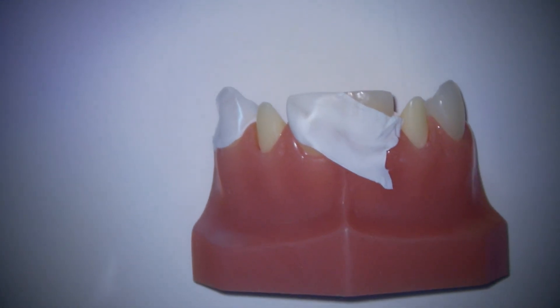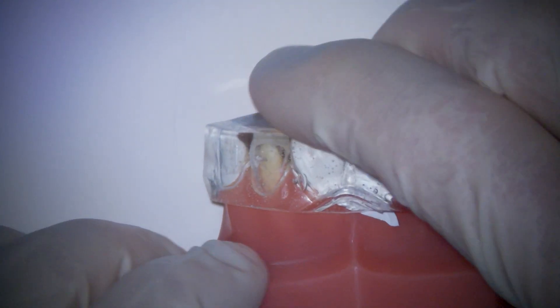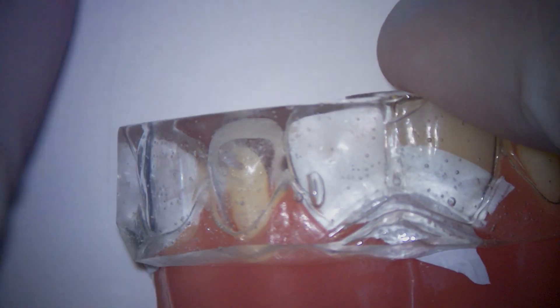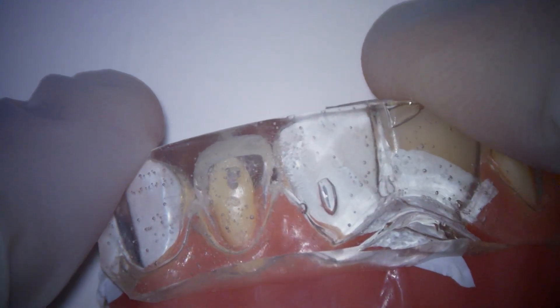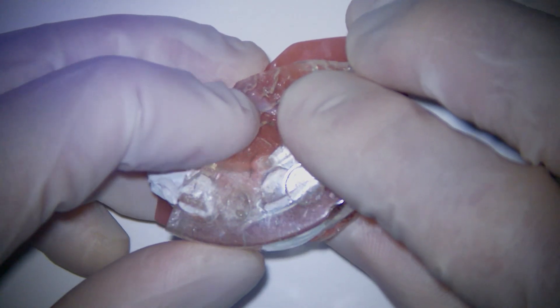At this point we want to fully seat our matrix. One of the benefits of having our Teflon tape on either side — how bright white it is — as well as the clarity of the GC ExaClear is that we can easily visualize that our matrix is fully seated. If for any reason you have voids or gaps at the incisal edge, something is off, so don't move forward. We want to make sure everything is fully seated and very well adapted, just like you see there on the incisal edge of tooth number 9. It is important that we are applying pressure on the distal, pressure on the mesial, and when we cure we are also going to be applying pressure buccal-lingually to make sure it is as well adapted as the matrix can possibly be.